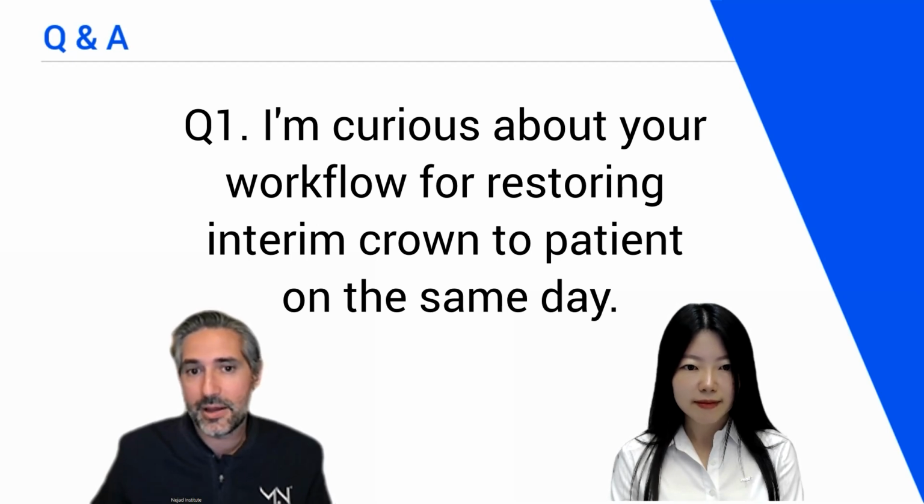I might have a digital design done before the appointment, but I'll usually use a putty and bisacryl material because overall, I've gotten to the point where I can make a nice fitting provisional for most restorations, especially my partial biomimetic restorations where they have to be shrink wrapped on. You can't necessarily cement them in. They have to wrap around the tooth.